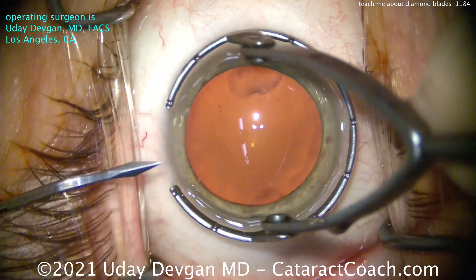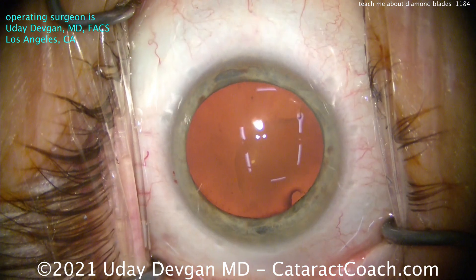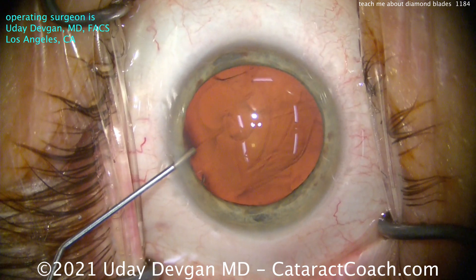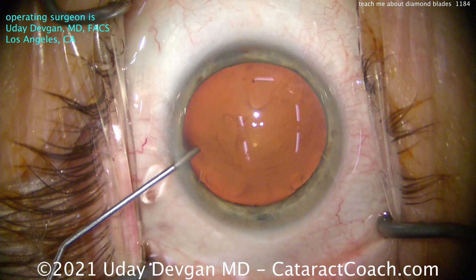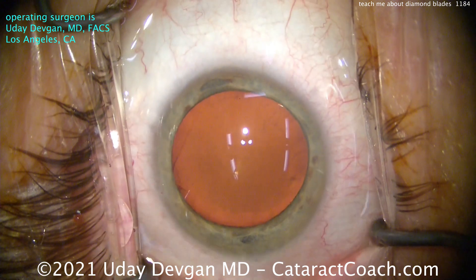I'm going to show you this whole case start to finish. It's five minutes, so hang in there with me. I've been using diamond keratomes for many, many years, and the reason is they're the best for making a phaco incision.